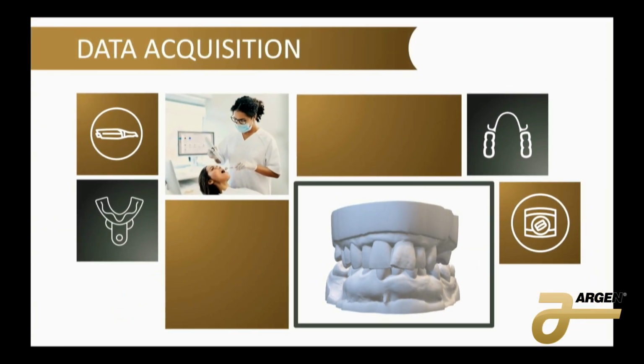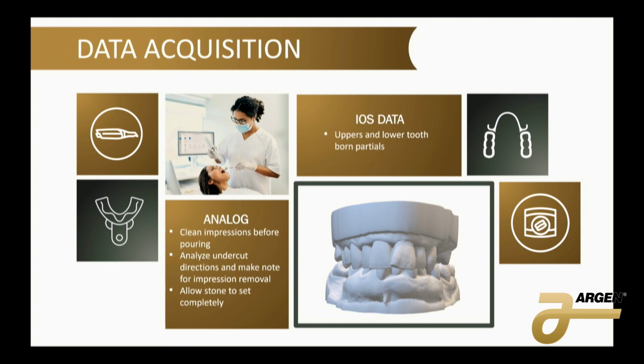So the first and most important thing that you want to be looking at is your data acquisition. I know working in a lab, working in removables, it can be difficult to get good data. It is okay to ask for a new impression. And if you get pushback, that's fine. Just ask every time. What are they going to say? Do your best. That's okay. Every time they send bad data, ask again. I need better data. Eventually, hopefully, maybe, they will start to understand that if we have good data, we have good products.